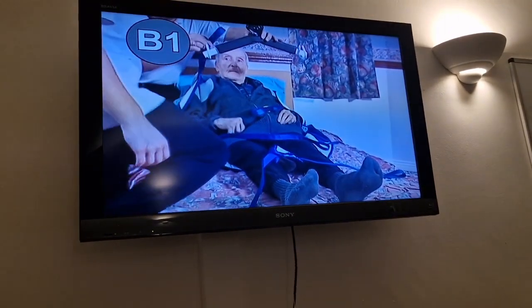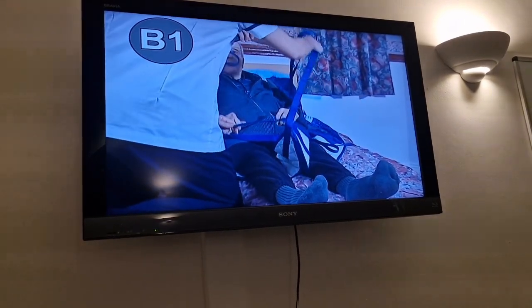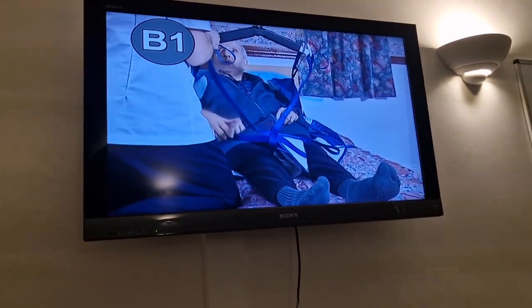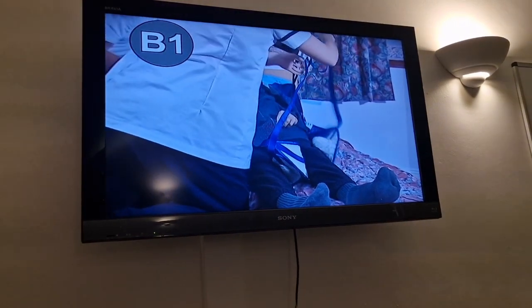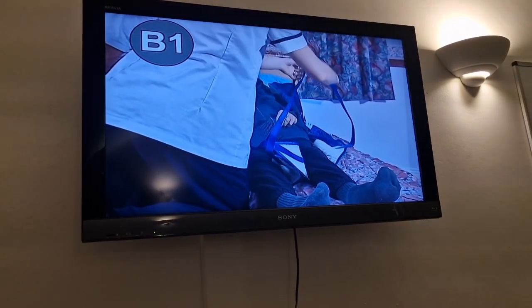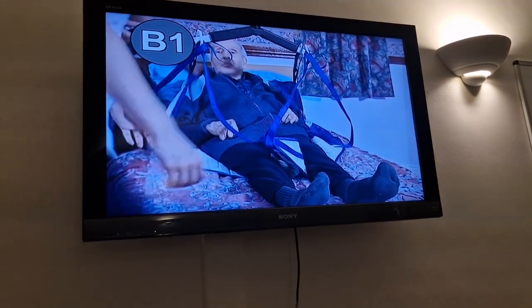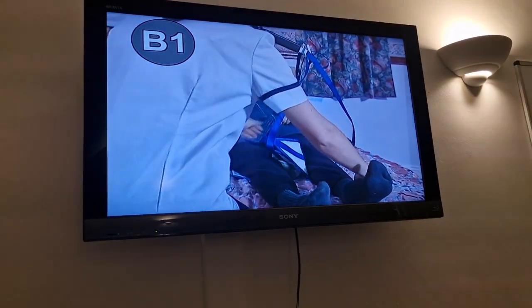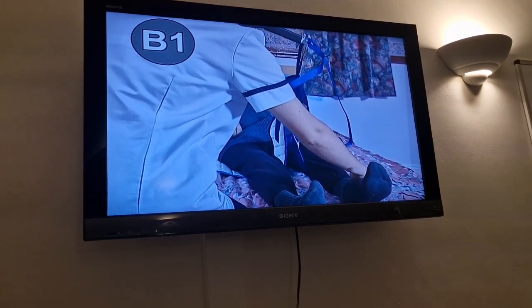Alright, we need to hook these straps on here. Ron's going to hook the leg straps on. Okay, Ron, can you take his feet? Hold on to the sling straps — that's right. We're going up the bed.